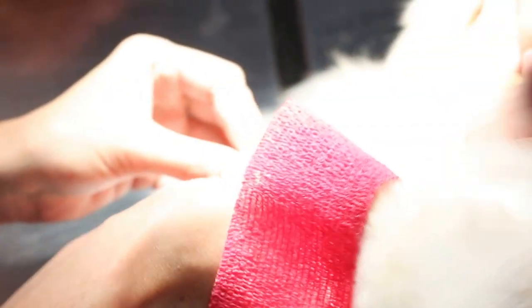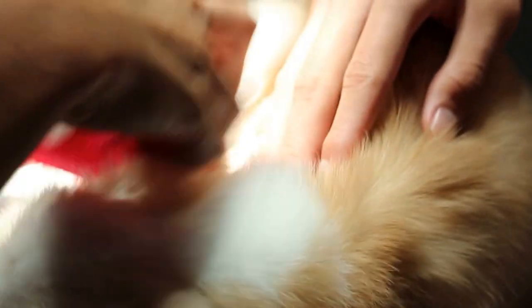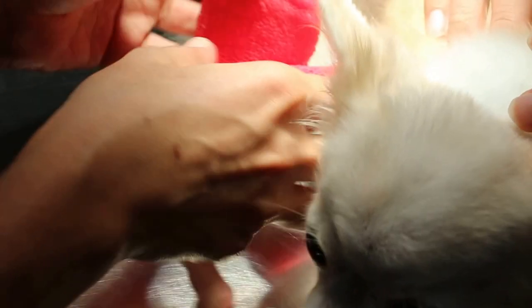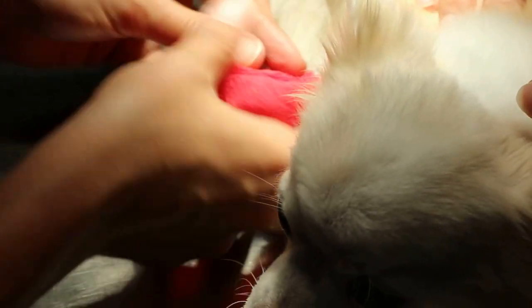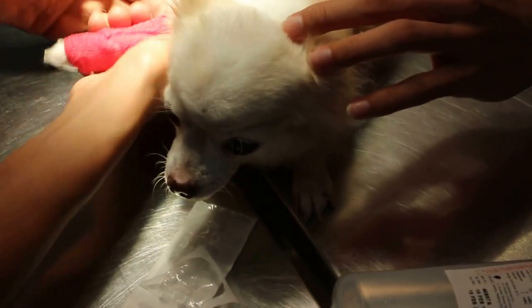Now you can see how the bandage is being put on. This is not the correct way — the correct way is to roll the bandage first, then unroll it. That is the recommended way. There are different ways of doing it, but rolling first is more efficient.